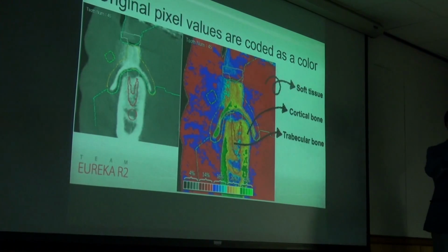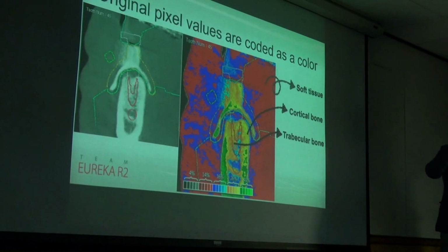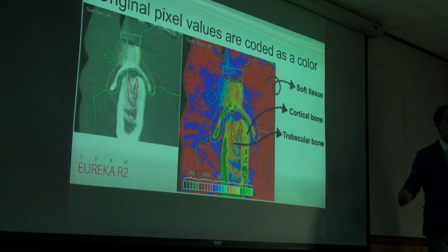When you're using a taper implant, especially in hard bone, sometimes your implant is stuck in the middle part. At that time, you cannot go forward or backward, right? How many people have experienced this kind of situation? That's because we cannot know the bone quality exactly.